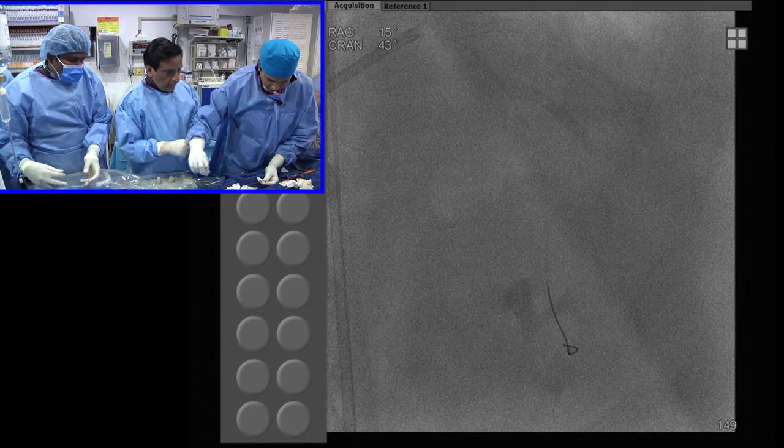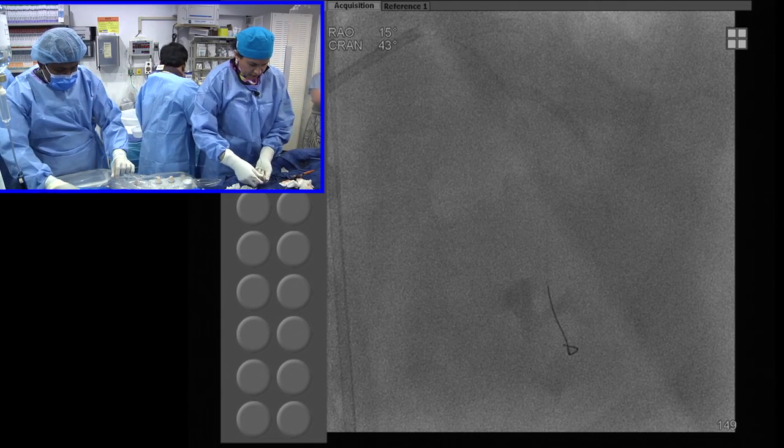Okay, this wire is out. How many people watching?